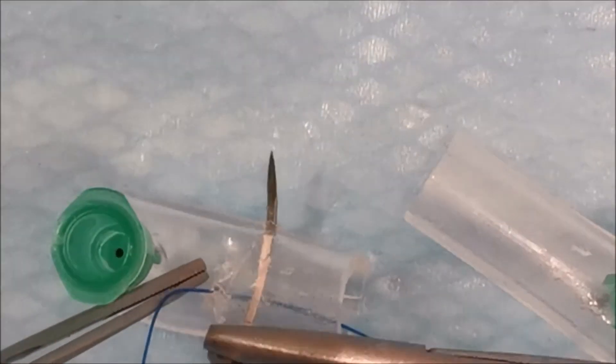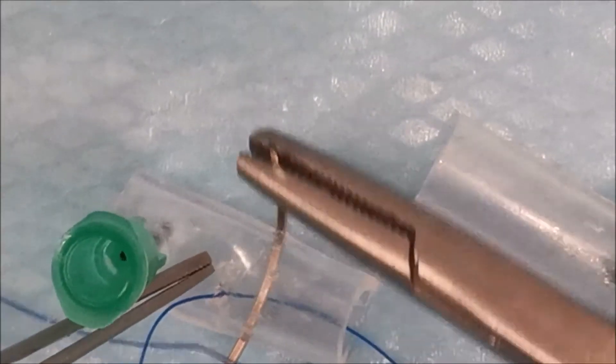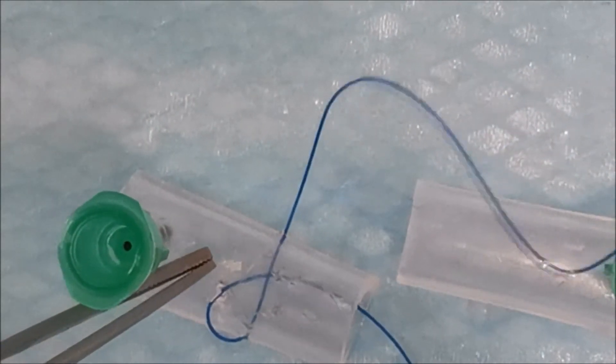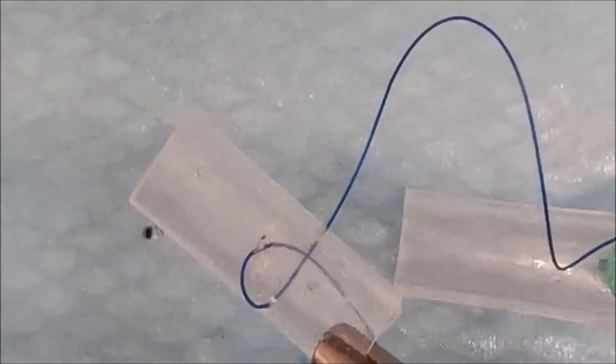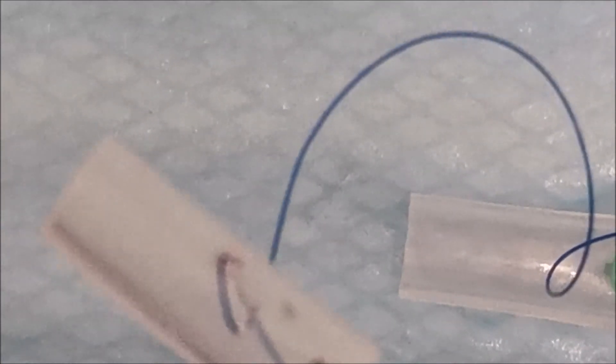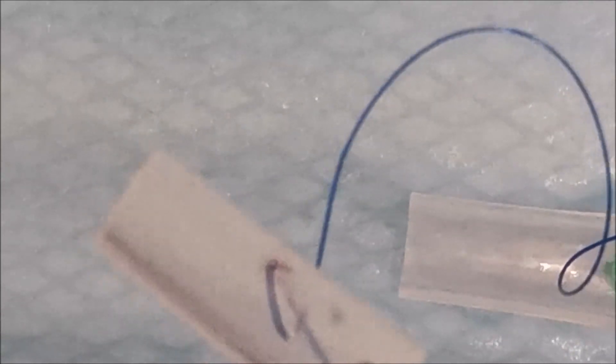If you did a normal good grasping loop and compare that, you'll see the percentage of fibers you're actually grasping with that loop compared to the previous one.